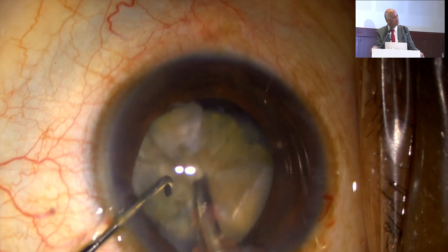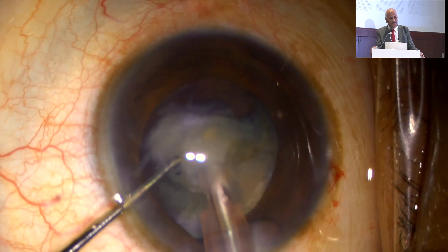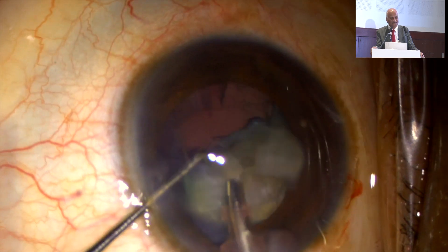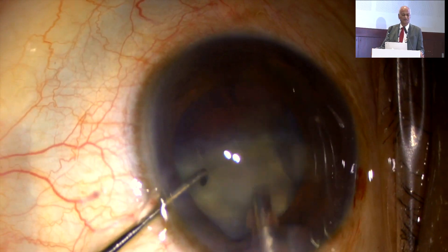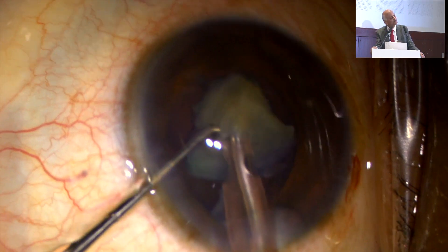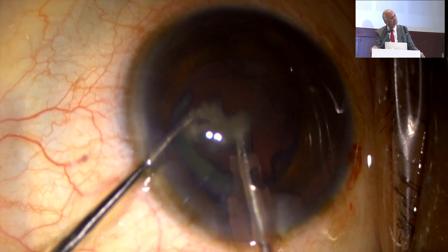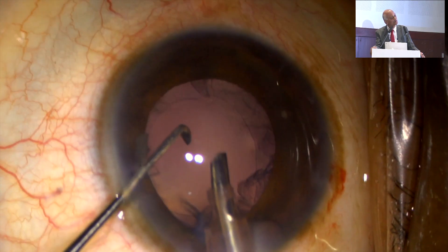Once I separate the piece — see here again — the piece is separated. Once that is separated from the other piece, otherwise the nucleus piece emulsification with faco will be difficult. When the last piece remains, go slow and complete the faco-emulsification. Such type of grade of cataract can be managed.